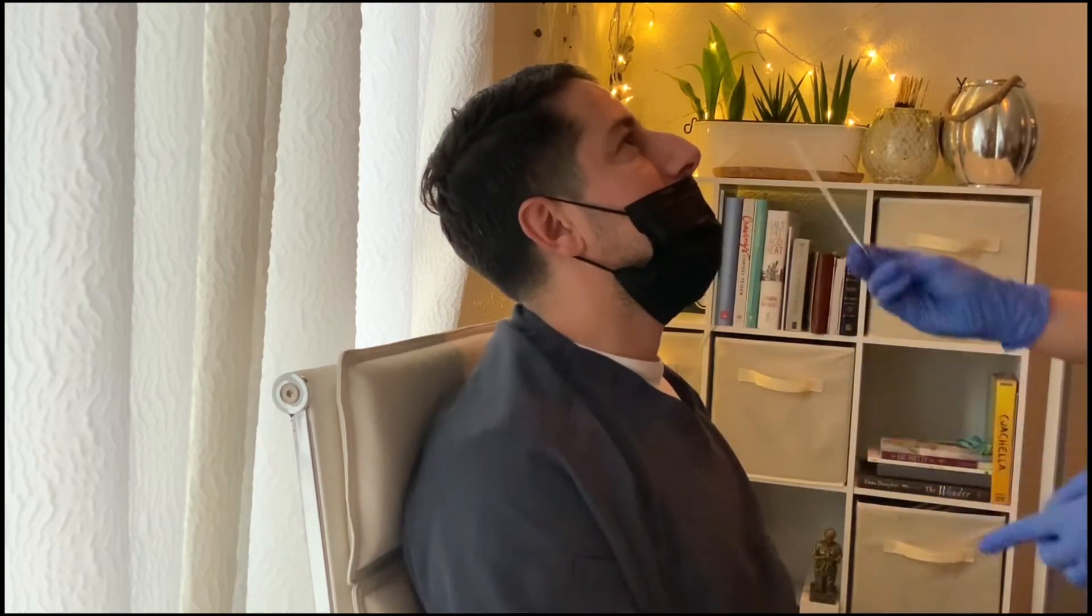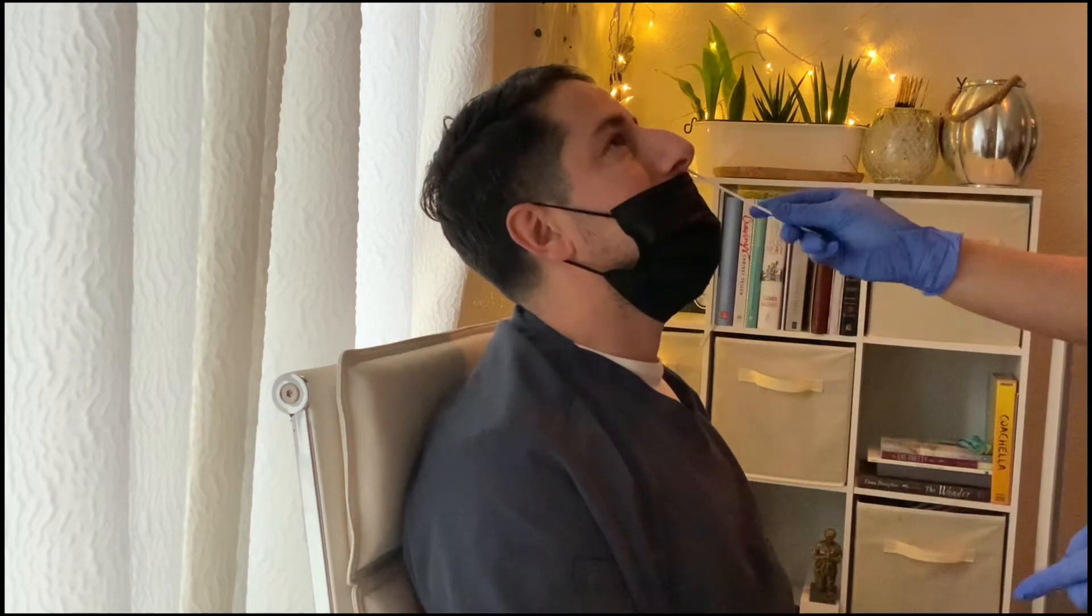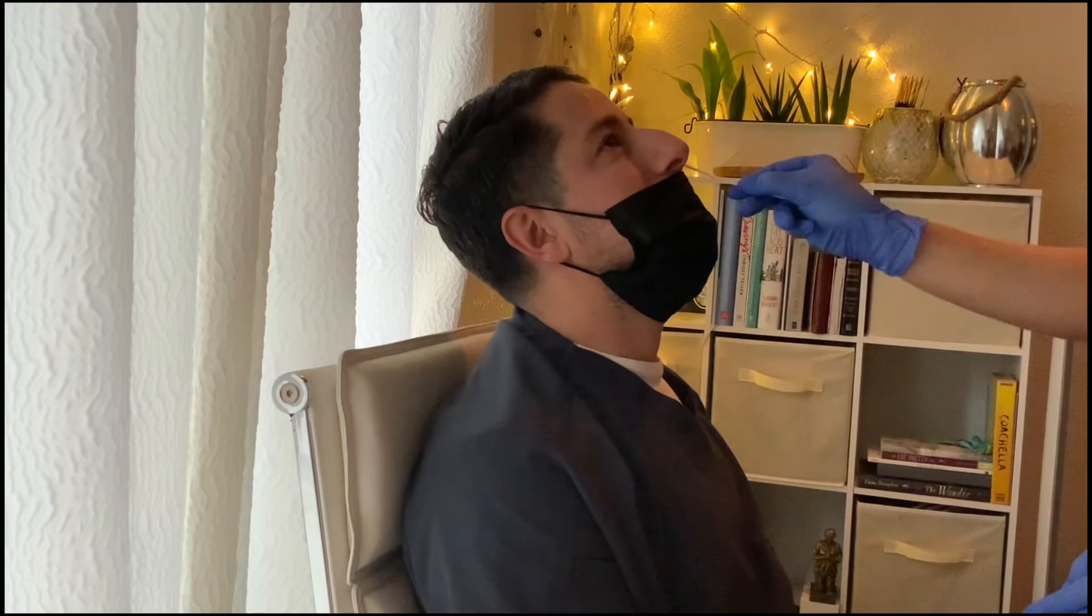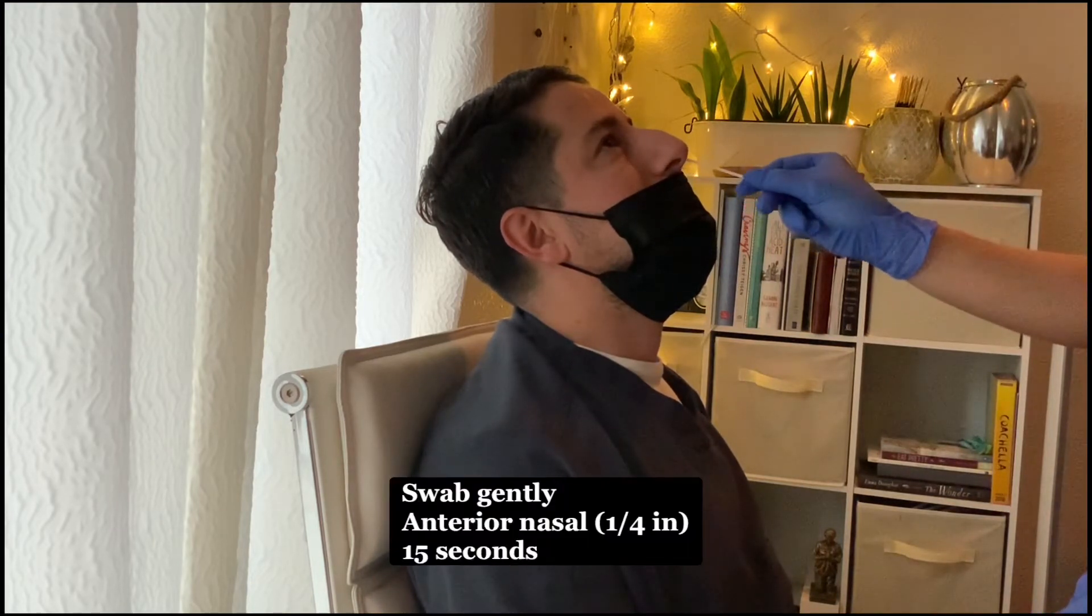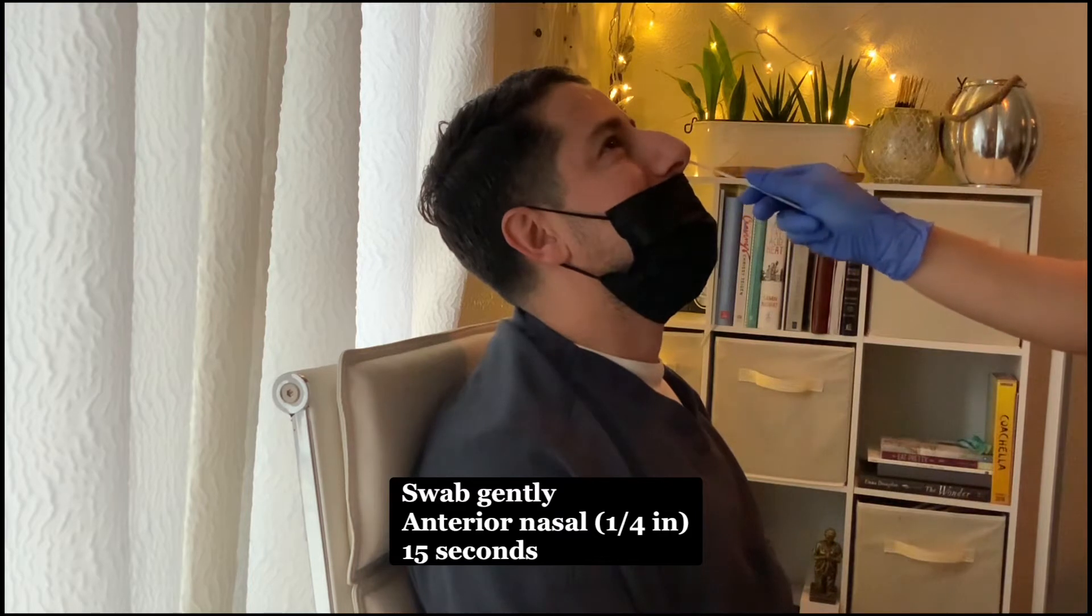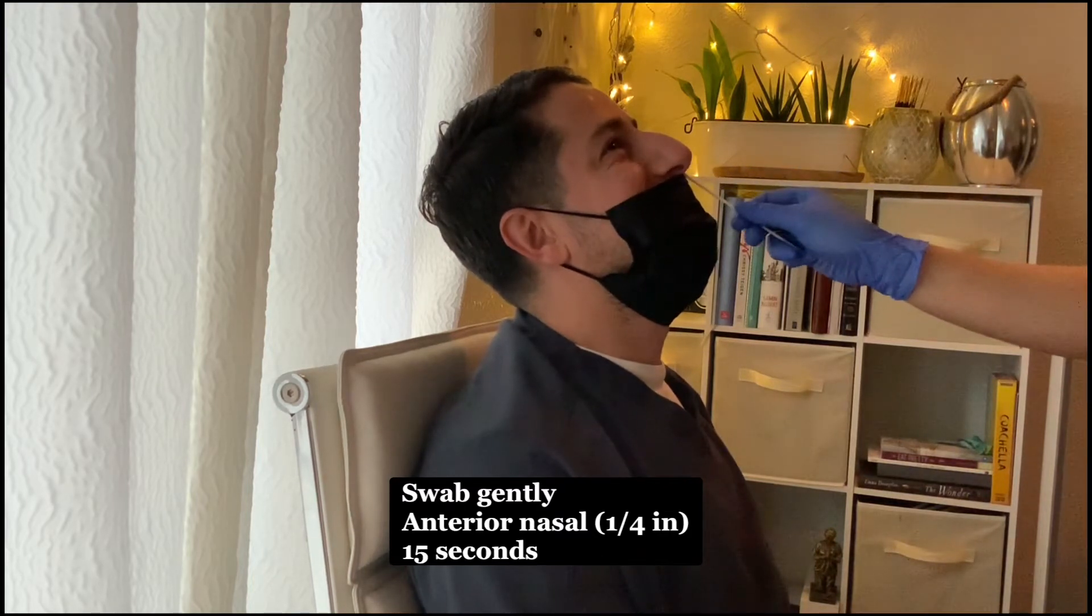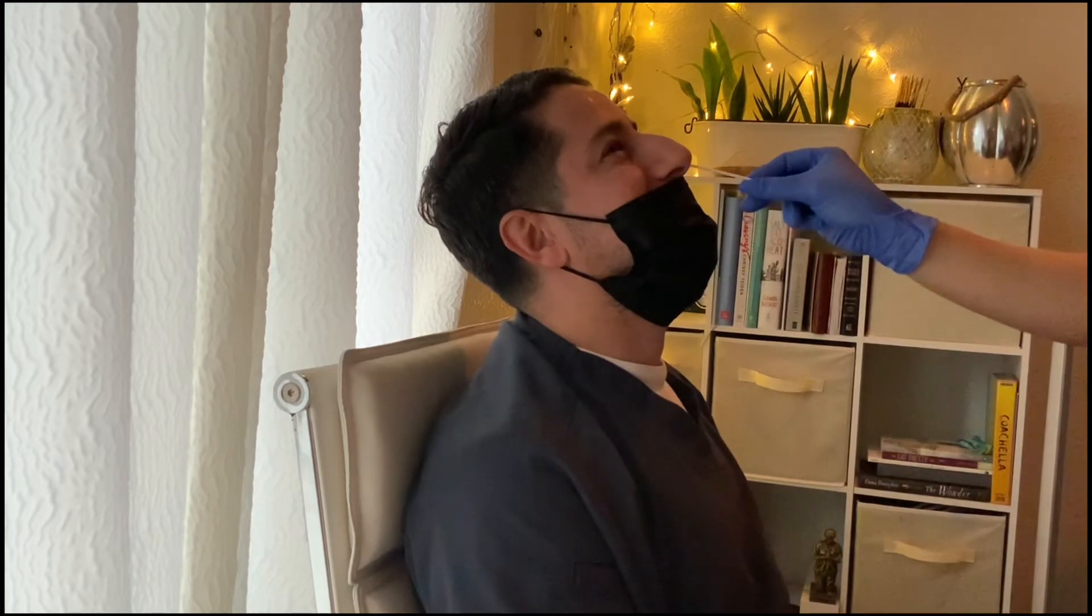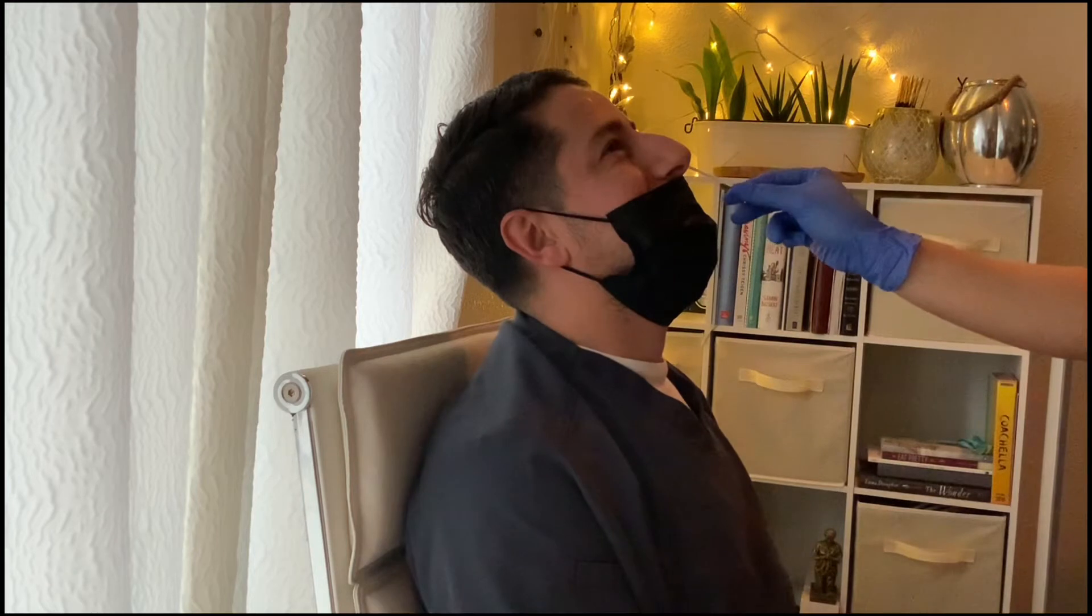Now you're going to grab this. Make sure you don't touch the tip of that Q-tip, just the end of it like this. I'm going to place it in the nostril, in the nares for 15 seconds. This is an anterior nasal swab, so don't go all the way to the top. It's not a nasal pharynx one. The anterior nasal swab is just enough so that it is able to immerse the Q-tip portion in there. It might tickle a little bit.